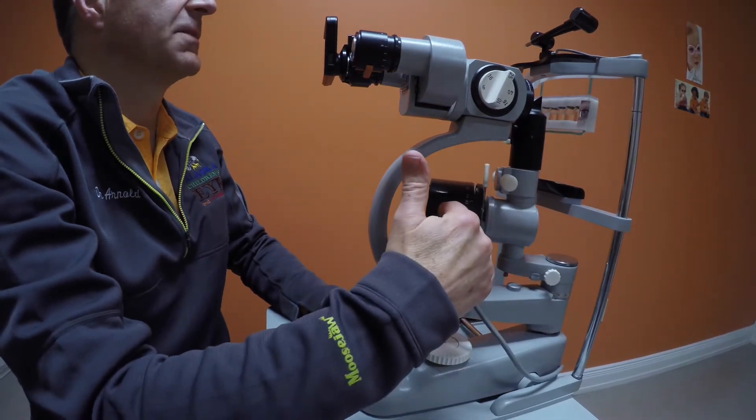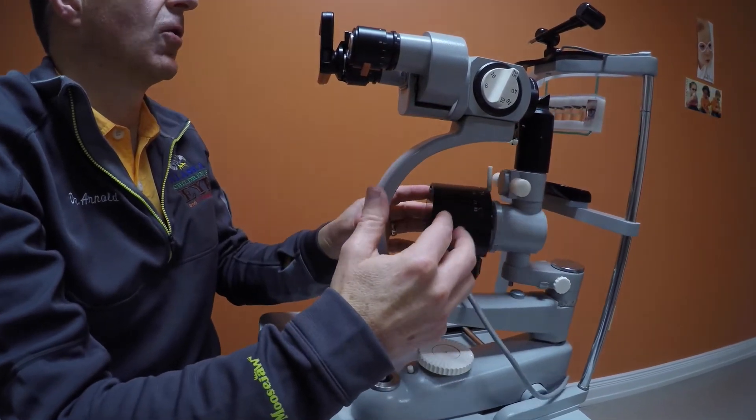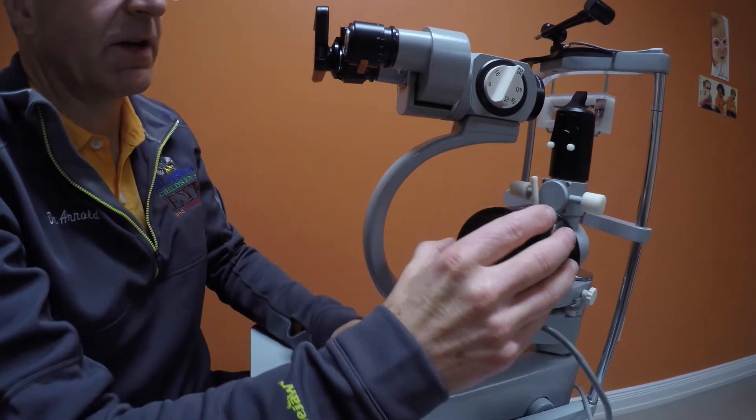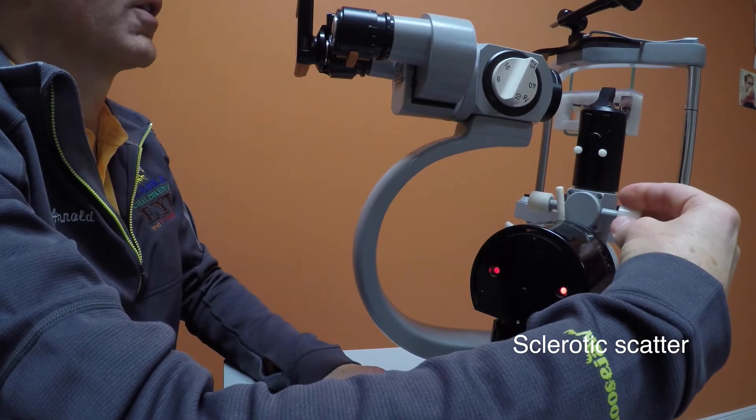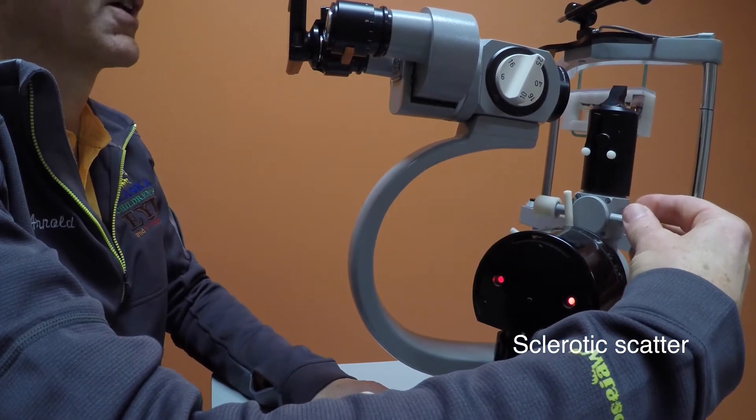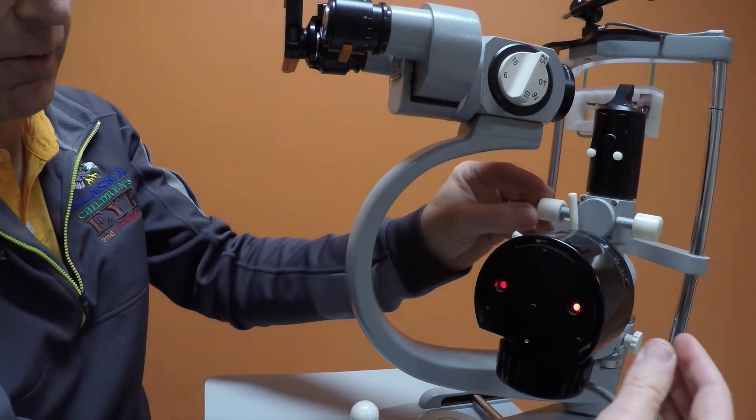We can have the beam come in from the left or we can have the beam come in from the right. The beam can be moved too far to the right or too far to the left, something that's called sclerotic scatter, but we want to keep that right in the middle.